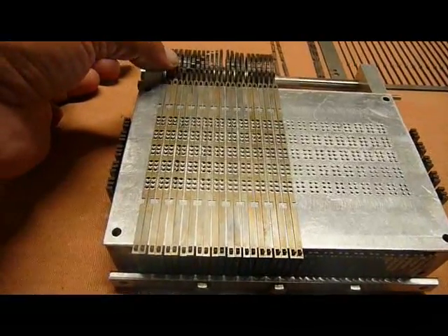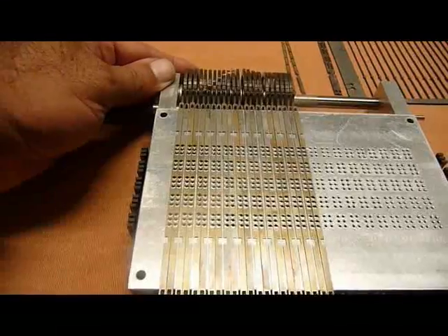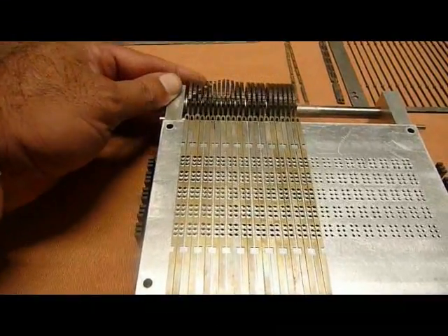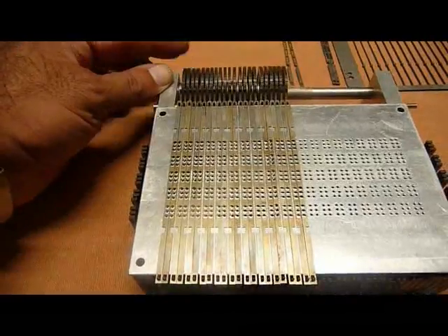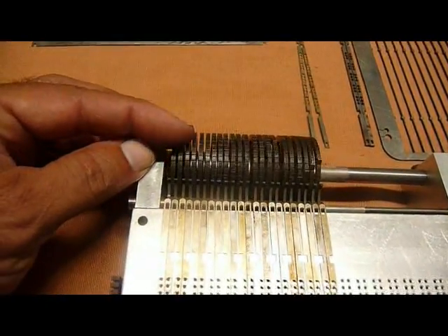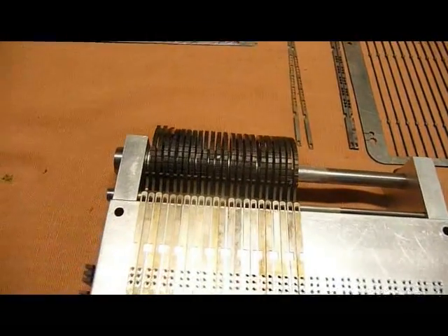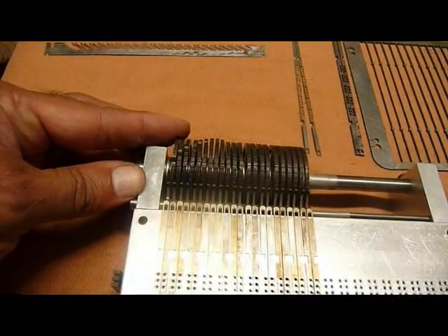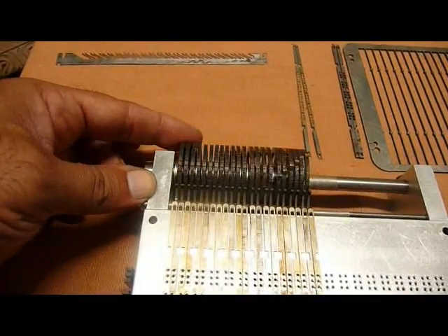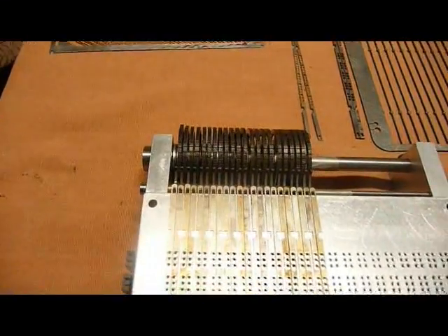You can see that you can move them a little bit like that, and when the cam rotates, it toggles them sequentially. I don't know whether you can see the little ripple. I'll go up to that. You can see this, the top end of the slides, a little wave, a ripple passing over them. That's showing how one slide at a time is activated.